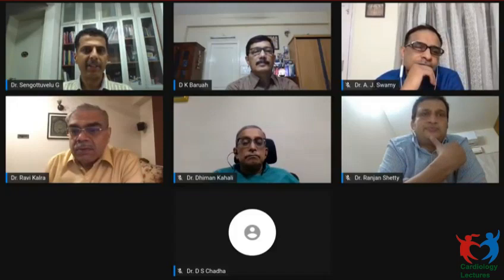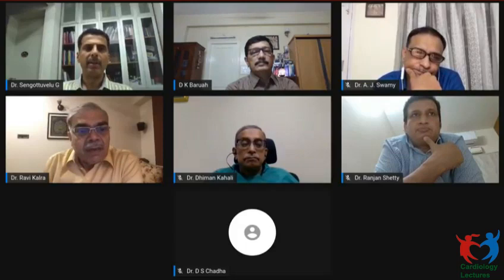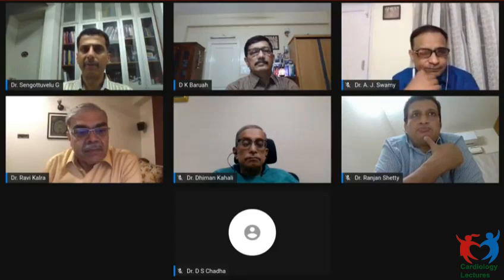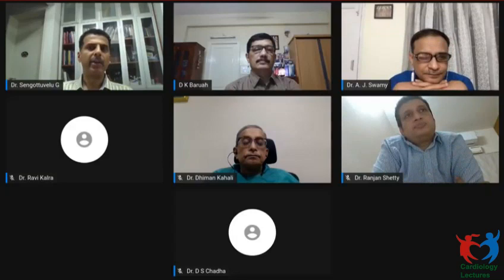Hello. Dr. Chadha? Okay, I want to bring an important point about the definition criteria. So based on the definition criteria, whether this needs a single stent strategy or a double stent strategy, with all of your inputs and from what we have seen so far, the definition criteria should have one major and two minor to call it a complex bifurcation. But here it doesn't appear to meet the criteria for complex bifurcation. So even if you use the definition criteria, we should try to use a single stent strategy.